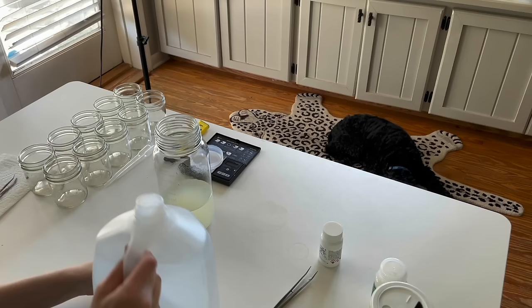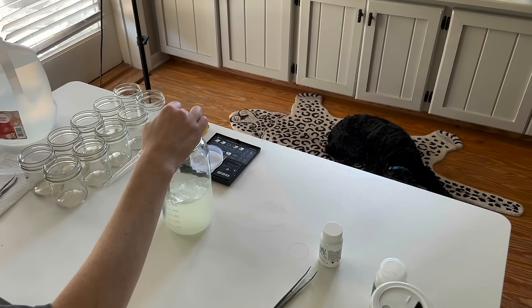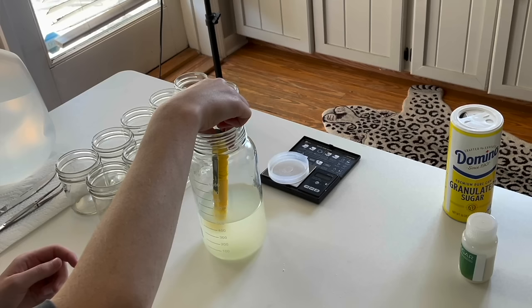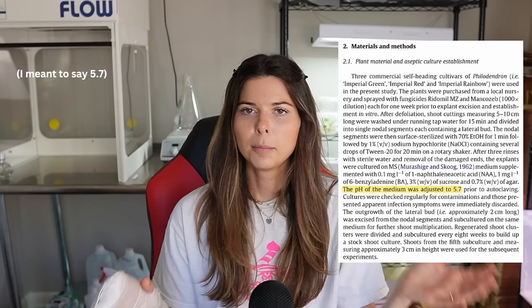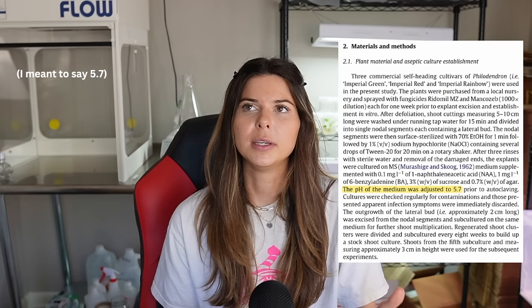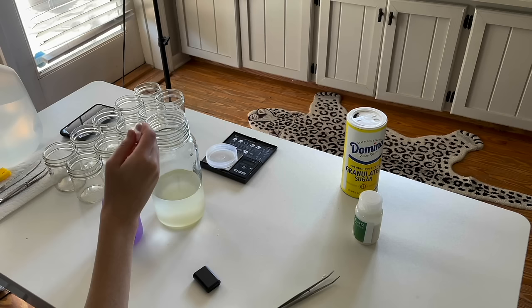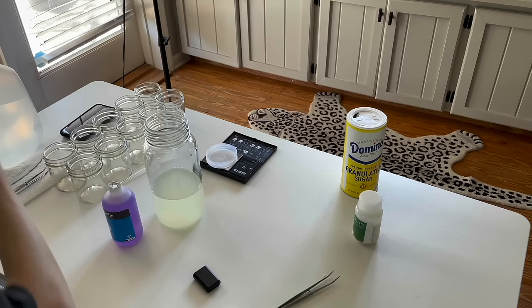After everything is added, fill the container up to 500 milliliters with distilled water, stir it up, and test the pH of the media with a calibrated pH meter. If you don't want to buy a pH meter, you can also use pH testing strips, but the meter was about the same price on Amazon so I opted for the meter. Per the protocol, the pH of the media needs to be 5.8 — it's typically between 5.7 and 5.8 for tissue culture. The pH is always too low when you start, so I use hydroponic pH up, adding a few drops at a time and testing so I don't overshoot.